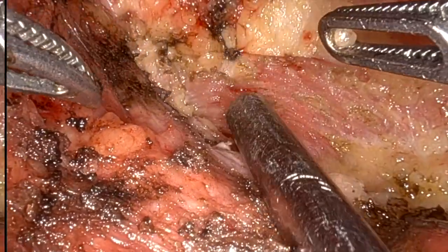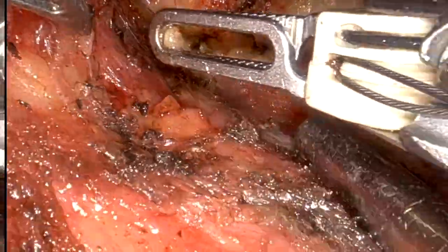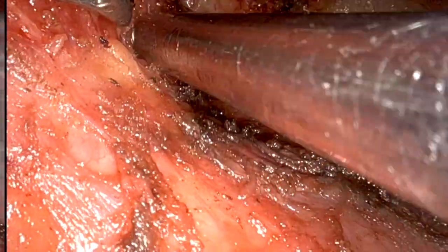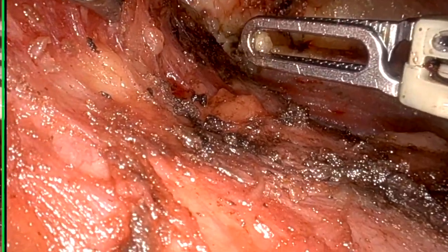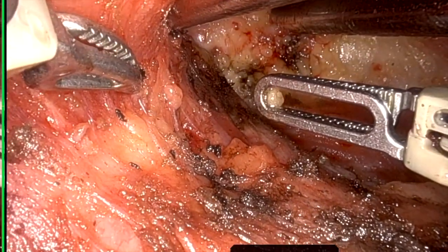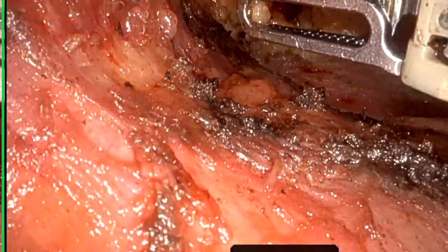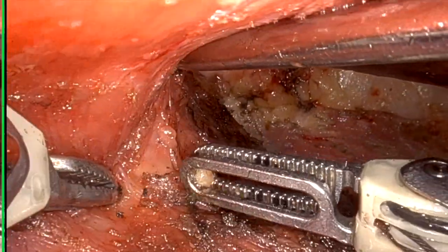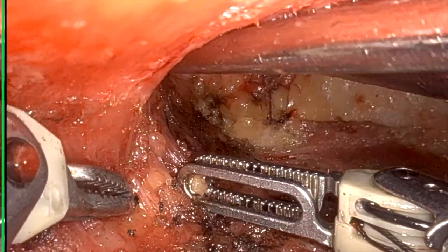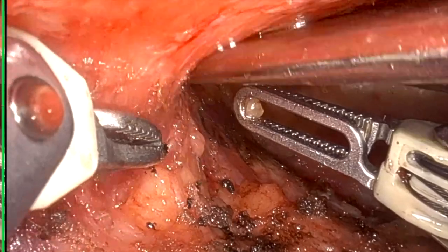Let's move to level 1B now. First challenge is to identify the marginal mandibular nerve. In this case, we are going to preserve angle of mouth and orbicularis oris muscle, so preservation of the marginal mandibular nerve is very important. Three important things about the marginal mandibular nerve. First, if you raise your subplatysmal flap correctly, it will definitely be one or two layers below the fibrofatty tissue above the mandible, not on the superficial layer.